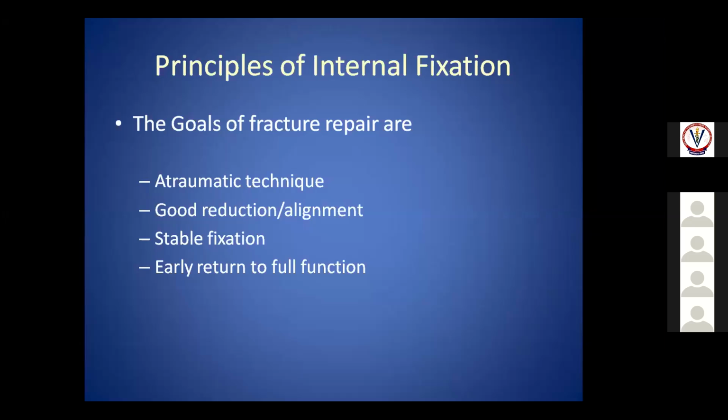So bone healing usually, depending upon the age of the animal and many other factors, we take it at 6 to 8 weeks maximum. Again, it may prolong depending upon the conditions. There are so many conditions that affect fracture healing. So usually we take a standard time of 6 to 8 weeks for the bone to heal. For that period of 6 to 8 weeks, the implant or the fixation device you are using should hold the fragments in that particular anatomical position until complete healing.